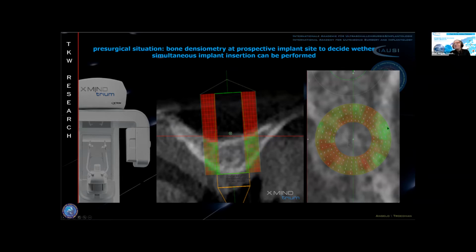But you can also see that in some parts around the implant, you can await a good bone quality. Since we already know from evidence-based and from experimental investigations, this was done already since 10 years, we know the values that are responsible for good primary implant stability.